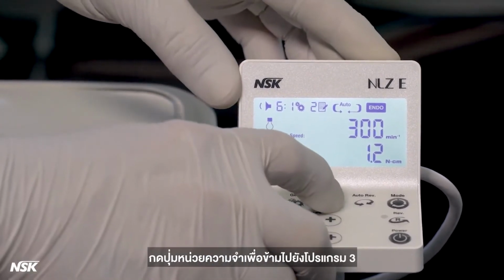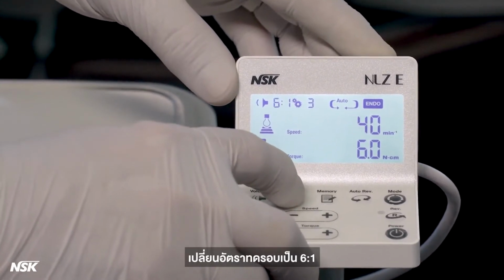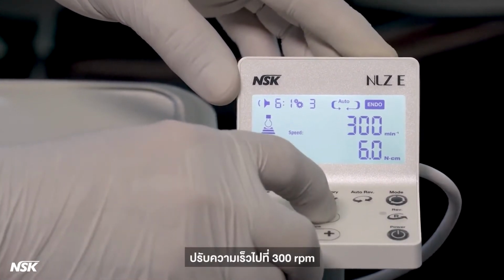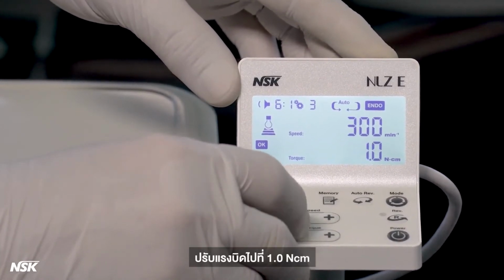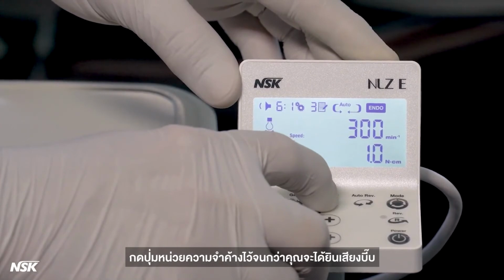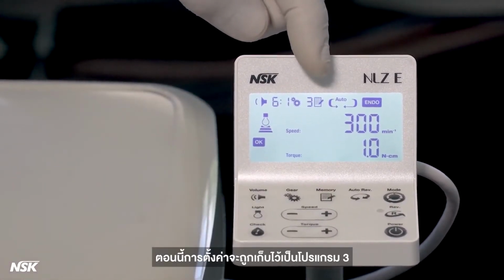Press the memory button to jump to program number 3. Change the gear ratio to 6-to-1. Dial the speed to 300 RPM. Dial the torque to 1.0 Newton centimeters. Press and hold the memory button until you hear a beep. Now the setting is stored as program number 3.